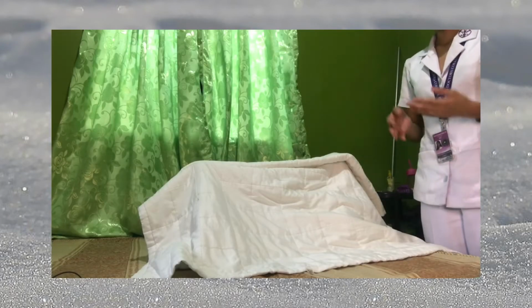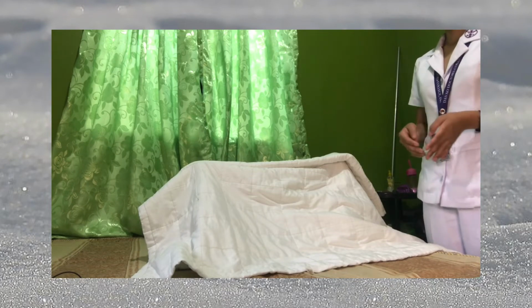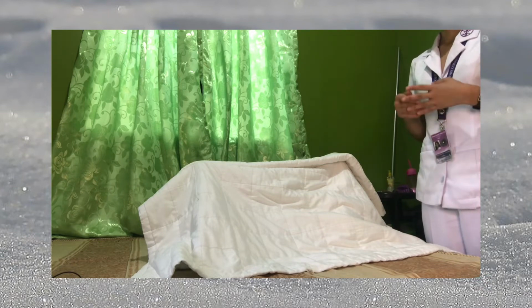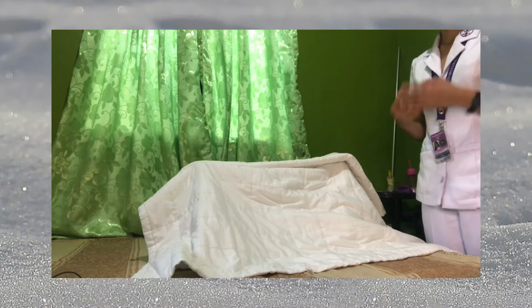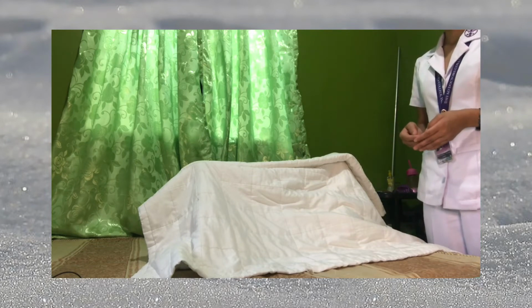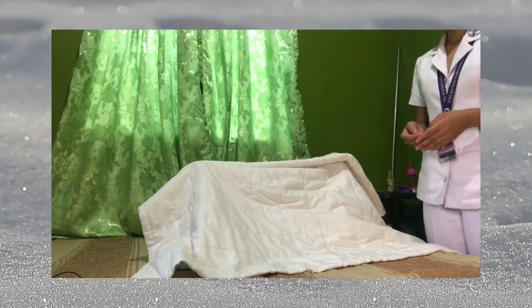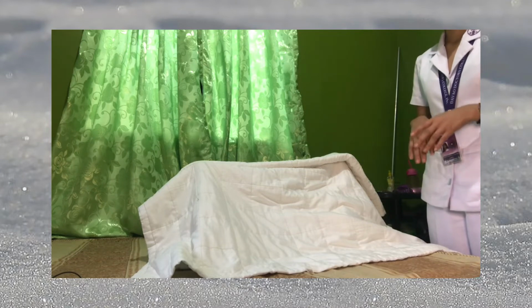Now, let's drape the patient, exposing only the area to be used. Embarrassment and chilliness can cause the patient to become tense. The tension can interfere with easy introduction of the catheter and direct visualization of the genitalia. So now let's drape the patient.